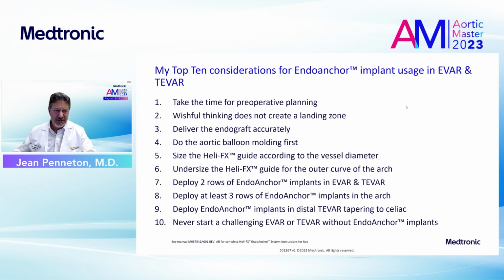So these are my top 10 considerations for EndoAnchor implant usage in EVAR and TEVAR. The first one would be to take the time for preoperative planning. Wishful thinking does not create a landing zone. You have to learn to deliver the endograft accurately, first of all. We do the aortic balloon molding before we do the EndoAnchor implant. You need to size the HeliFix guide according to the aortic diameter, but you do need to undersize the HeliFix guide if you want to put EndoAnchors on the outer curve of the arch.